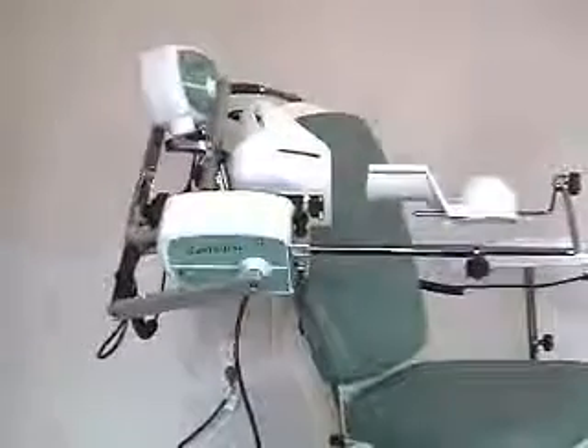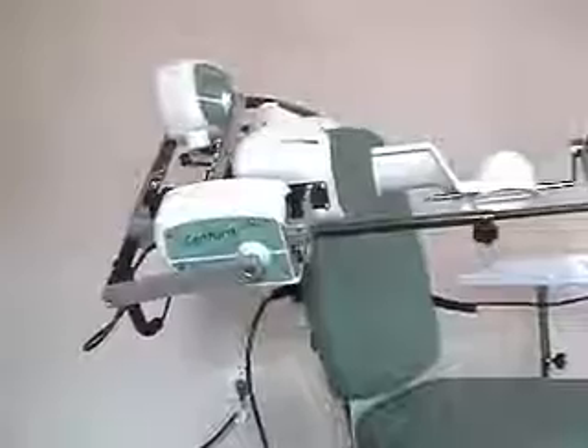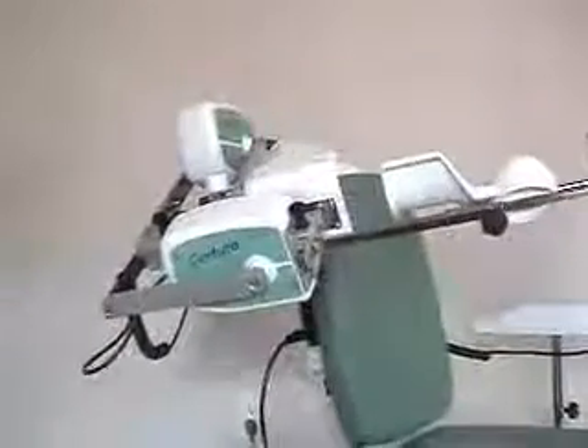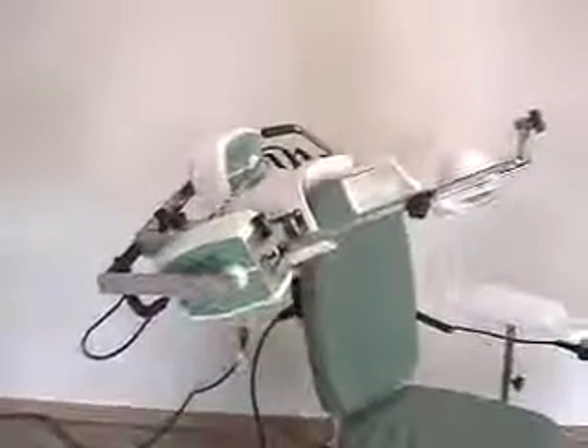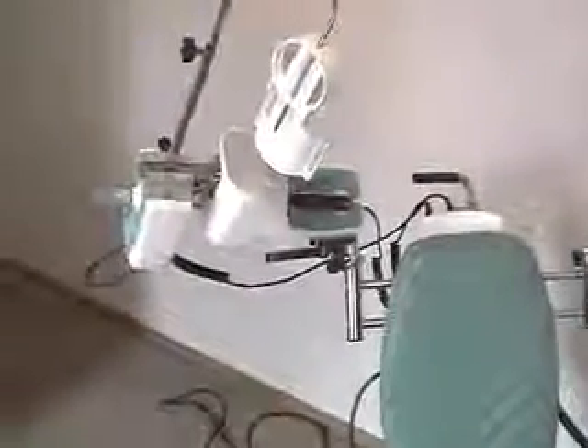Here we have synchronized abduction and adduction with rotation. You'll see that there is rotation going on at the axis of each of the two motors. This rotation motor in the foreground is rotating for internal or external — in this case external rotation. Motor M1 is going up into abduction.